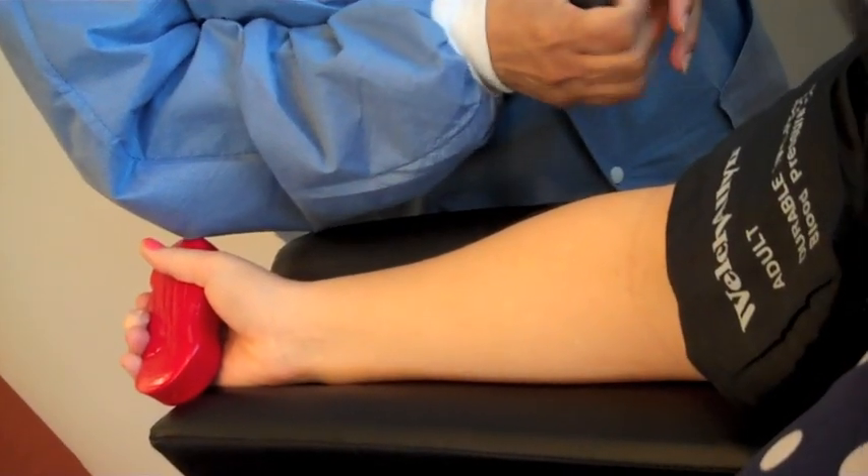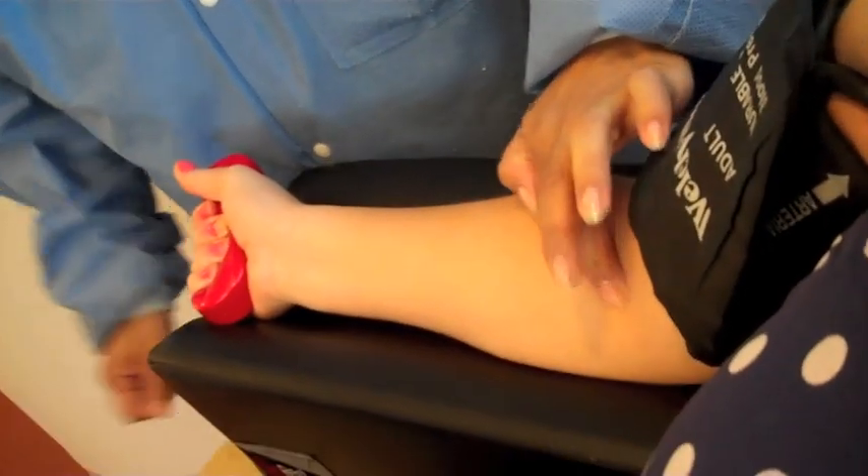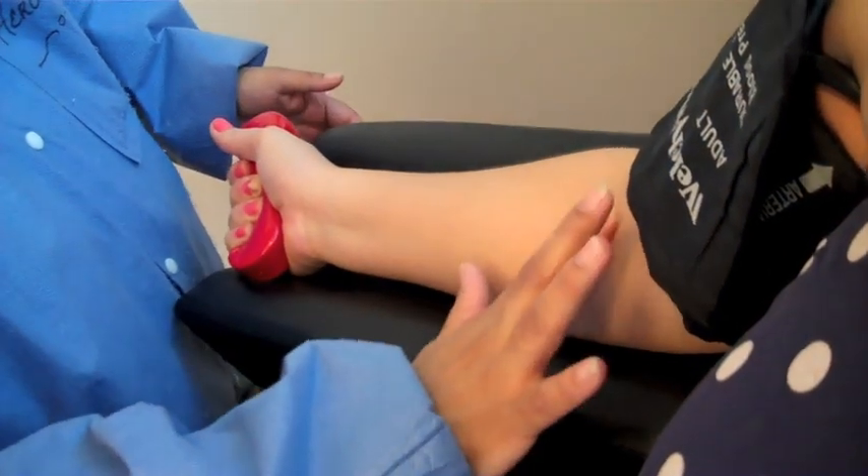I have small veins, so it's always a struggle to find where they can draw blood, but I still think it's important to donate. The way we're going to do it is I'm going to start pumping on this device right after she puts on the blood pressure cuff. She's trying to find a vein, which hopefully won't be such a big deal for most people — but in my case it's always a problem. Once she finds a vein it will be easy to put the needle in and I'll be donating. No big deal.